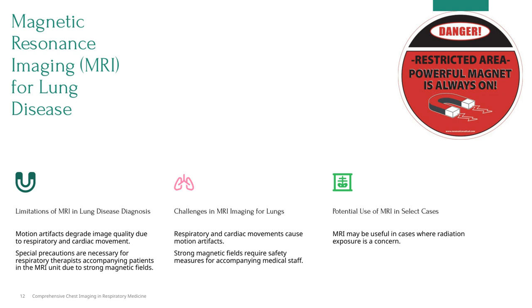The strong magnetic fields require them to take extra care to avoid any risks. Despite these challenges, MRI still holds potential, particularly in certain cases. For example, when we want to avoid exposing patients to radiation, MRI can be a valuable alternative.